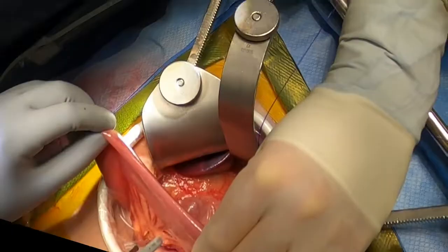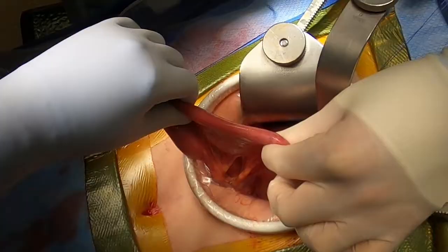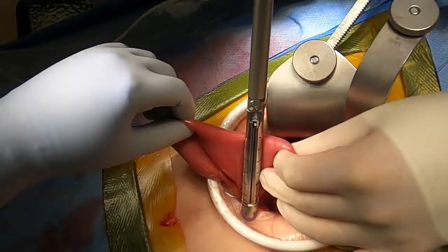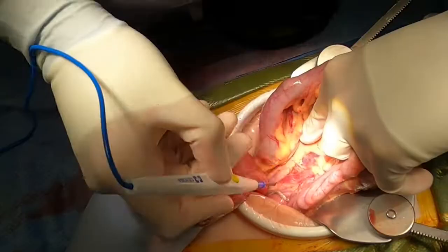While waiting for pathology's evaluation, we turn our attention to the jejunal limb. Approximately 20 cm distal to the ligament of Treitz, the jejunum is divided with a stapler. The mesentery is divided, taking special care to preserve the arterial arcades. A defect is then made in the mesocolon through a bare area, and the Roux limb is brought through the mesocolonic defect in a retrocolic fashion.